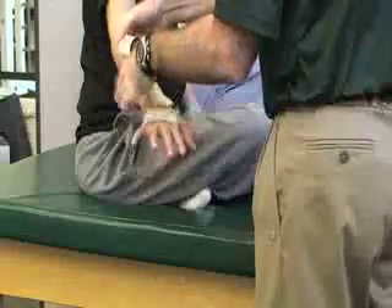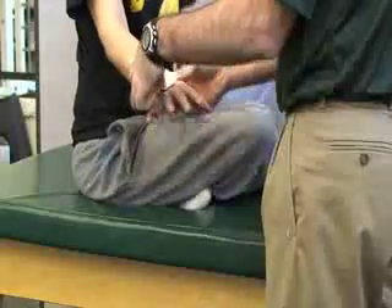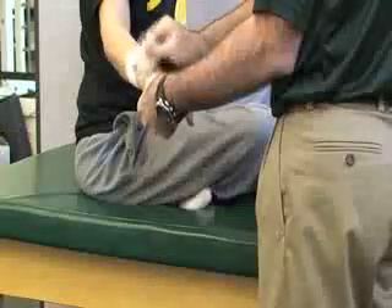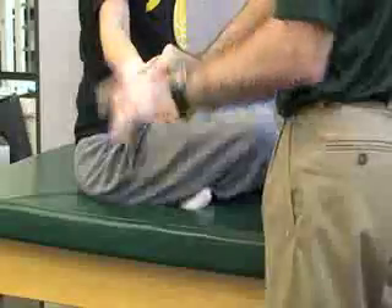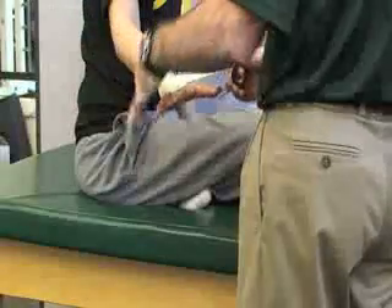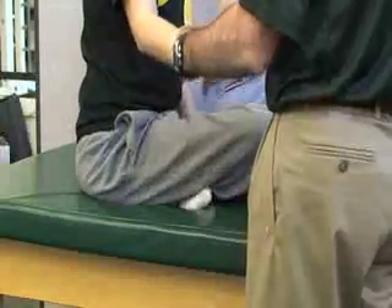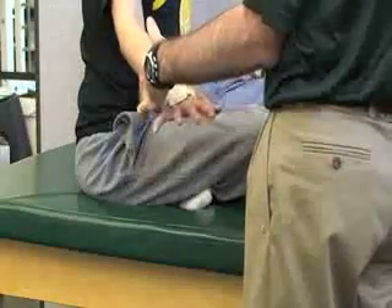Test it before you apply it. If it's not good enough, hyperextend a little bit more and reattach it to see if that's more effective. Have her spread her fingers, make a fold for the thumb, and come around. If you were just preventing hyperflexion, you would close this up now.